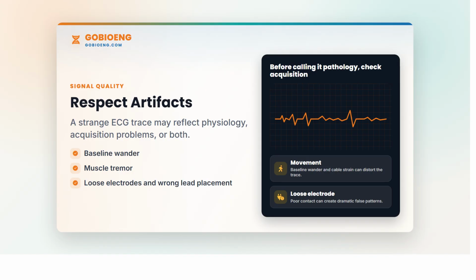ECG is also part of the story of space medicine and remote monitoring. NASA's Holter Monitor 2 was a commercial ECG monitoring device modified, flight qualified, and used on the International Space Station for human research. Spaceflight made remote physiological monitoring especially important because clinicians could not simply walk into the room and examine the astronaut. The lesson is bigger than space.